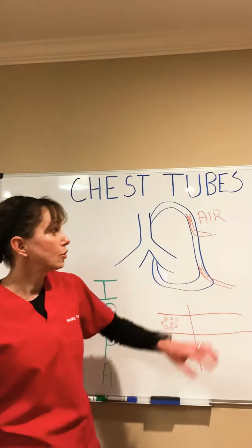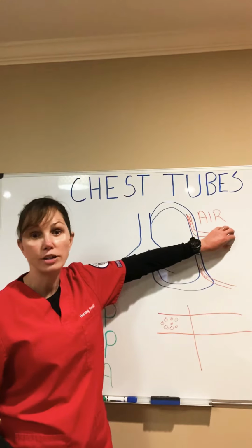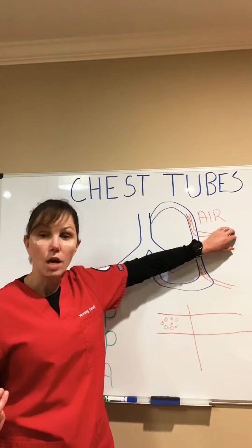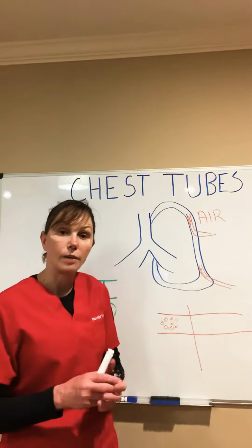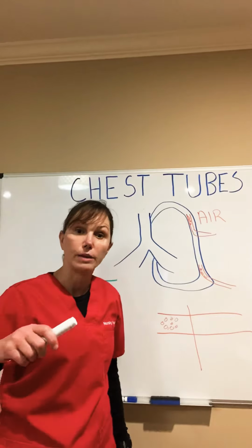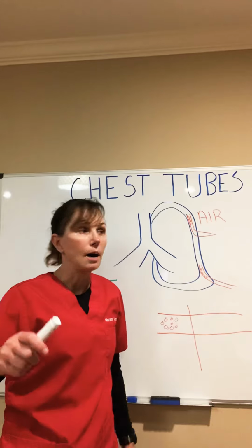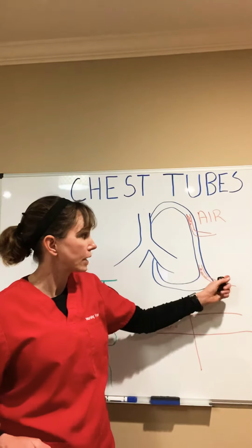Also, you want to make sure that these tubes are always patent. Make sure your patient is not lying on it. I mentioned in another video that if these get occluded, you may see the tidaling in the water seal chamber stop fluctuating. So look for that, okay? But you want to make sure these are always patent and they can drain freely.